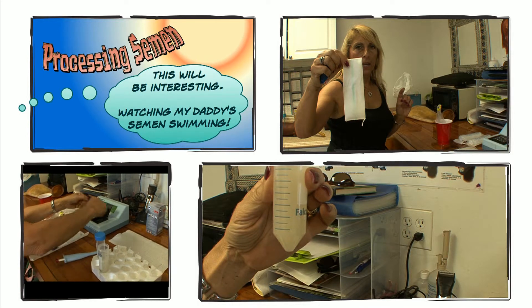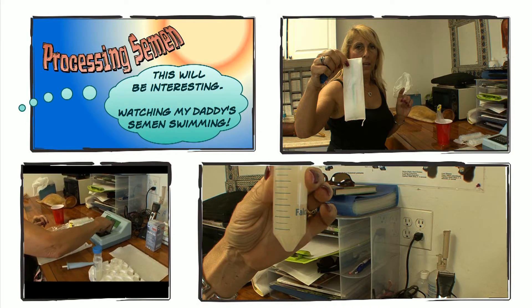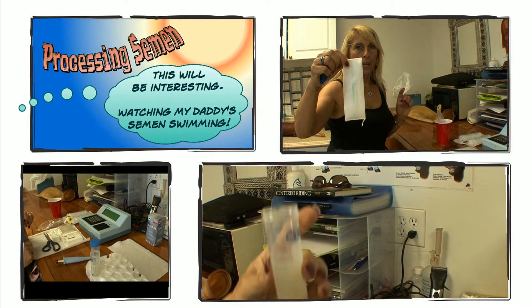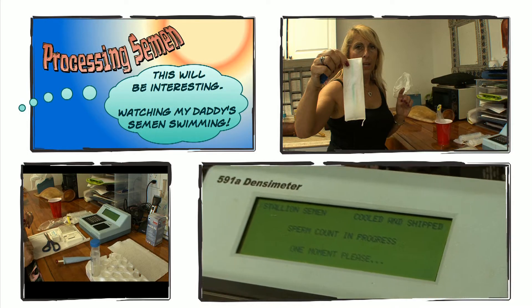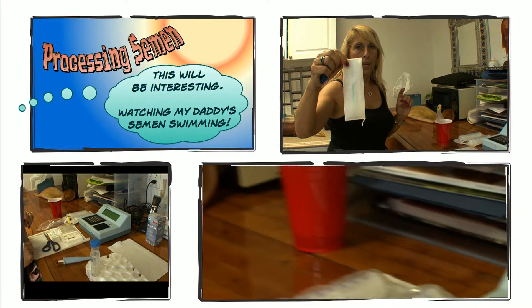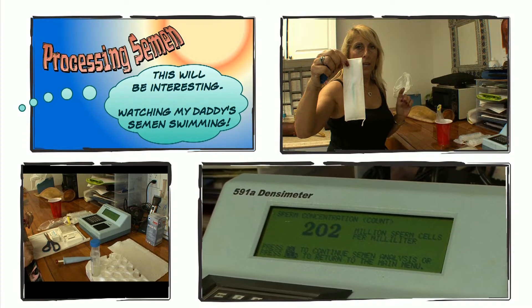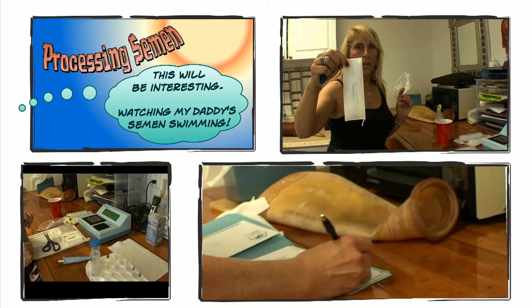Cover this up, get a little twist here, and press go. We have about 33 cc's of semen. Karen is providing us with a paper so we can document everything. Our count is 202 million sperm cells per milliliter. We know we have 33, so you multiply 202 times 33, which this machine will do for us.